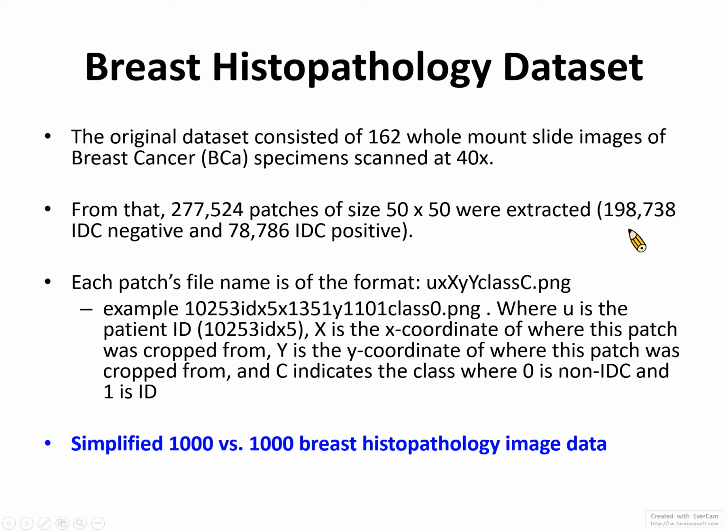This contains 198,000 IDC negative patches and 78,000 IDC positive patches.